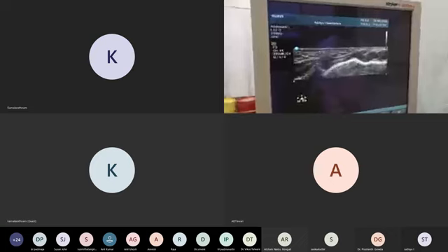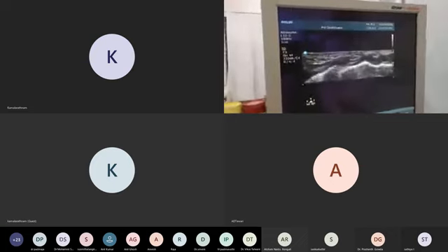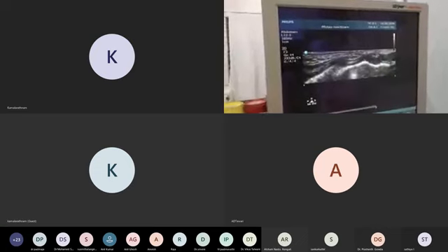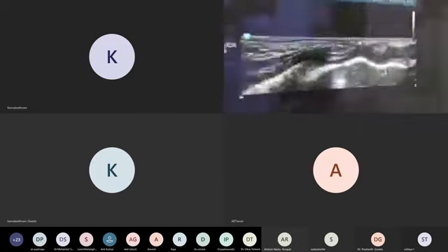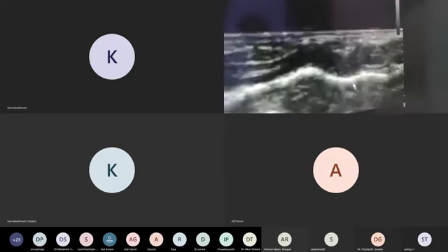If you'll see more detail, this is the maximum. I can go 1 centimeter below. If you will see here, see this, if you can come near to me, near to that, near. Okay, hold on. See, I can see 2 lines.